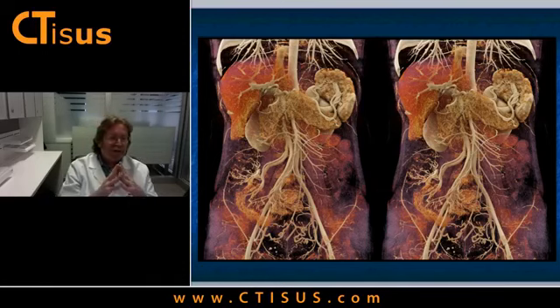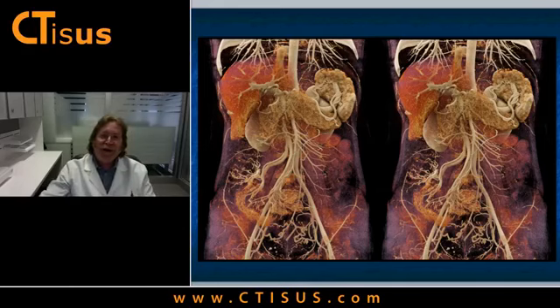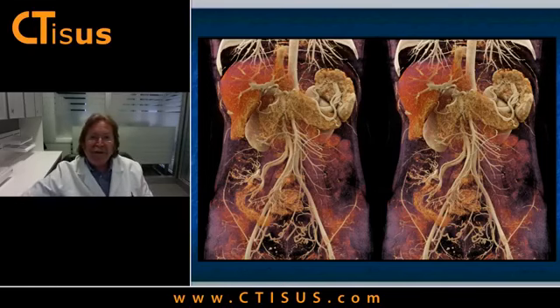So with cinematic, we've been looking at a range of processes. Where cinematic works out is really in the same areas that classic volume rendering, supported by MIP, works out. So it's really not reinventing the wheel, but perhaps providing a different way of looking at things with more detail. And I think that becomes very, very important for us.